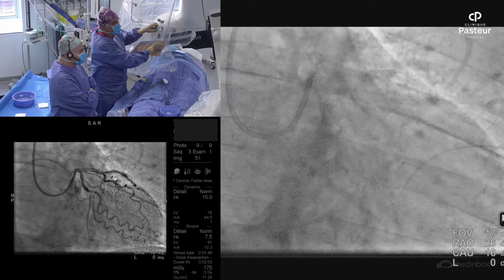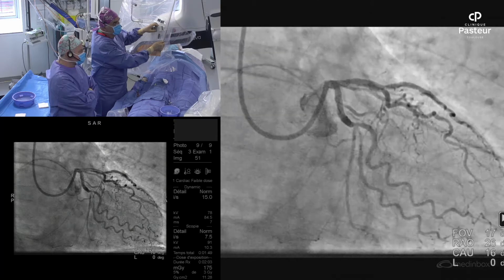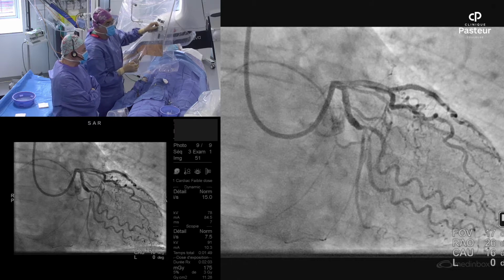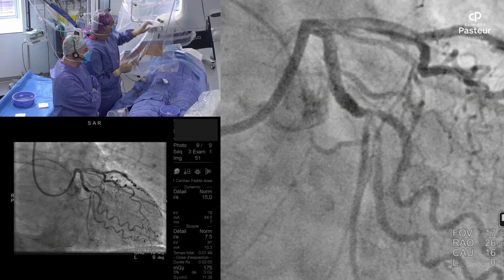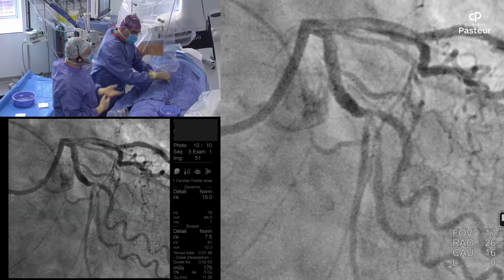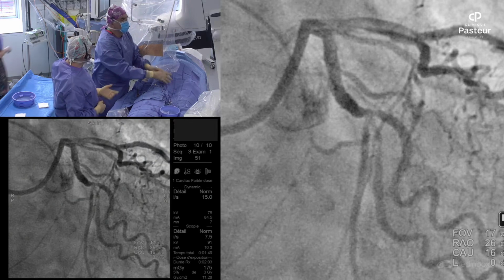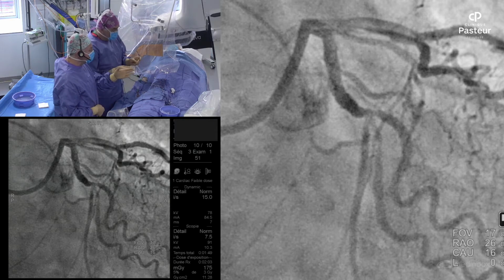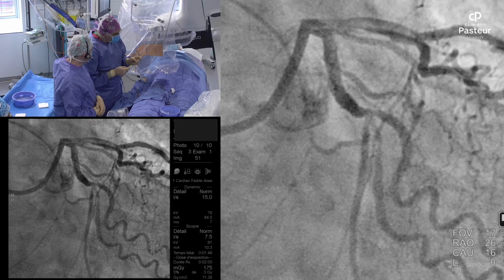So certainly I would say 2.5 for the distal. The question after is how to evaluate the proximal part, because if you consider it a trifurcation, it could be at least 3 and maybe a little bit larger. If we consider that the second branch is at least 2.5 millimeters or so, it will be close to 3.5 for the POT at the proximal part.